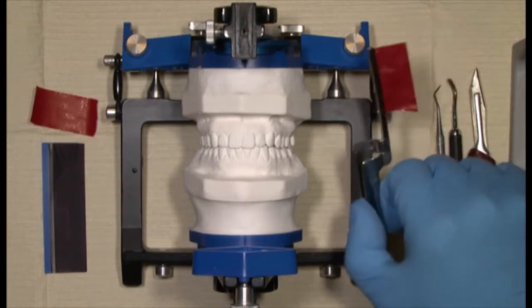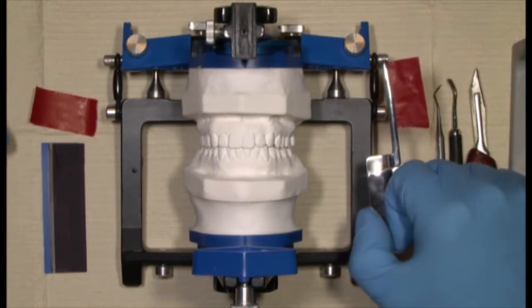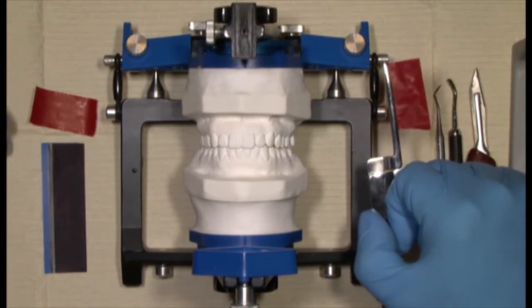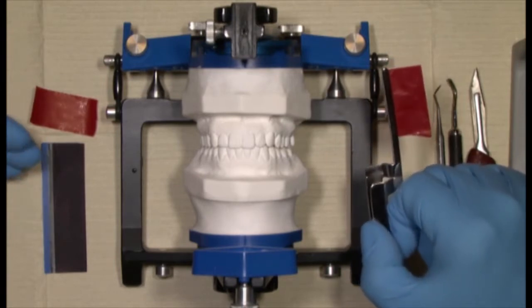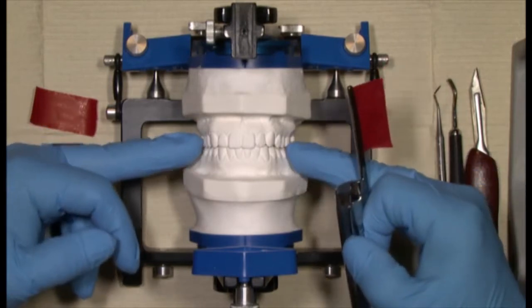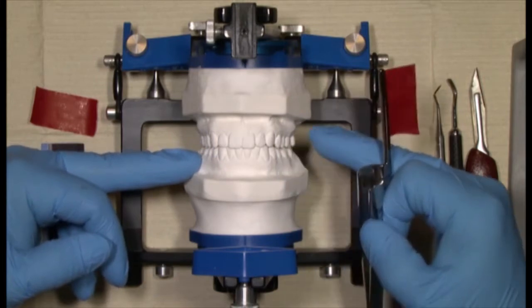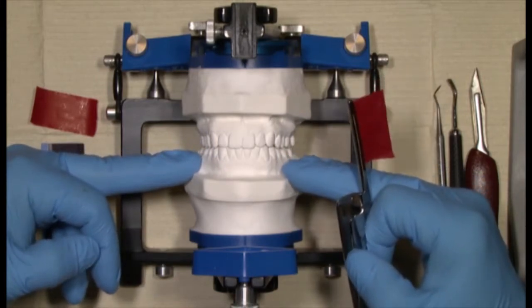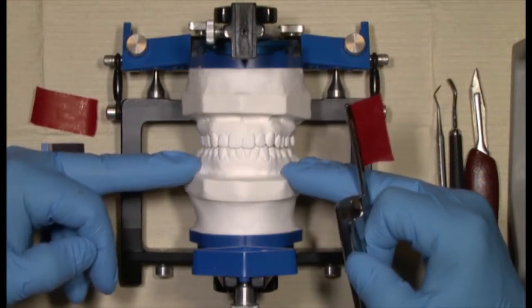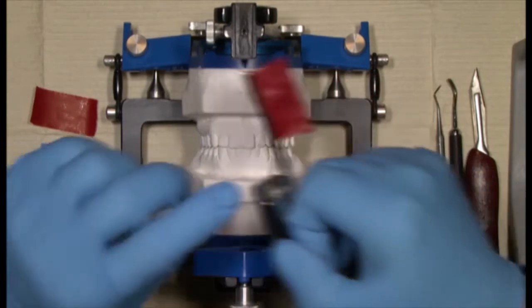If we can validate the mounting is correct, then we can quickly determine if the objectives that we need to achieve can be achieved through the use of equilibration. What that means is, do we have to consider maybe orthodontics, orthognathic surgery, additive components to this procedure, or can we just do a subtractive equilibration and achieve our goals?